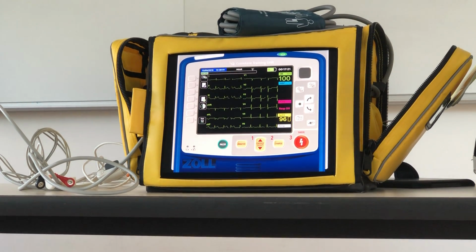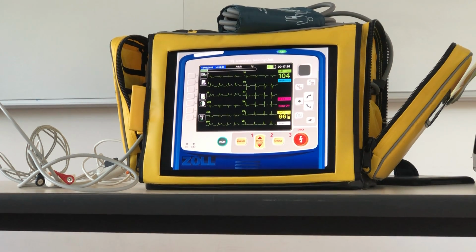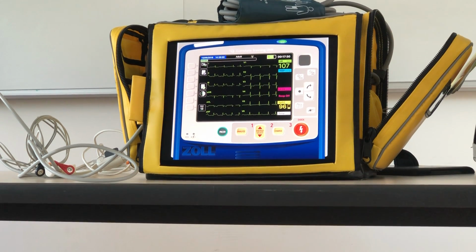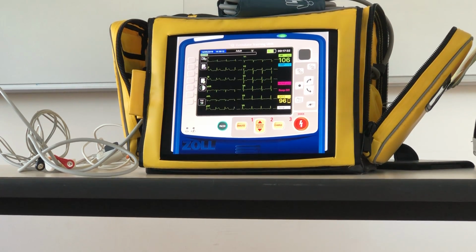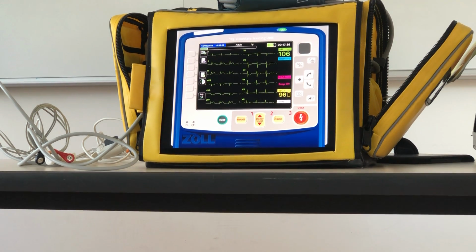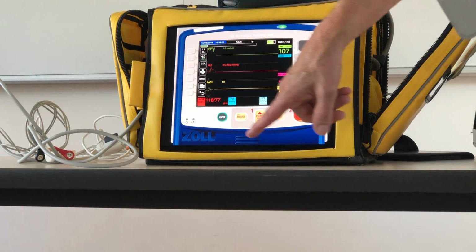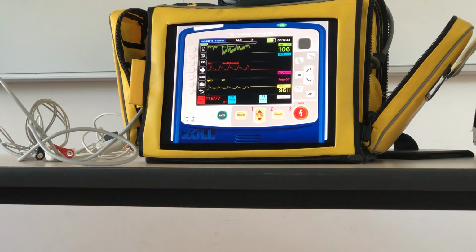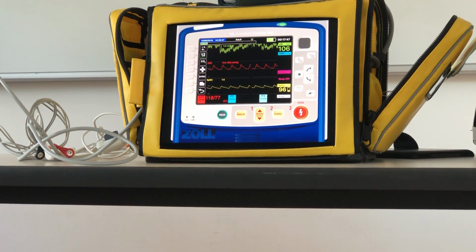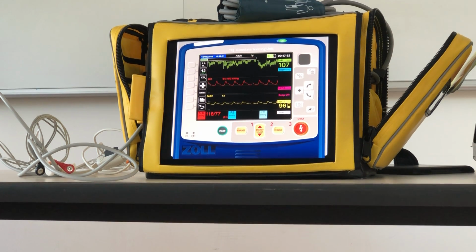Anyway, so let's see. They've got artifact. So if you want to add electrical artifact, you can. You can put in a baseline. I didn't give it any amount to it. There's kind of a range of artifact that you can do, and maybe that's not showing up on the 12 lead either. Yeah, so you can throw in all kinds of 60 cycle interference and things like that. And again, you can do that on any of the rhythms that they have.